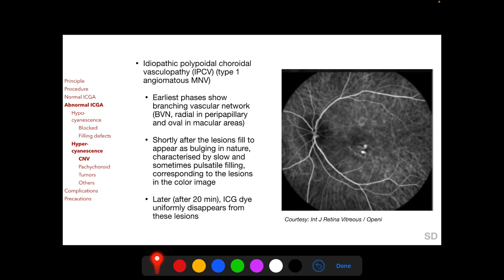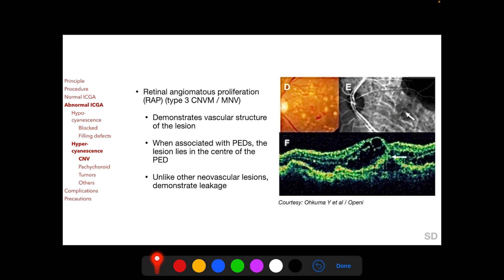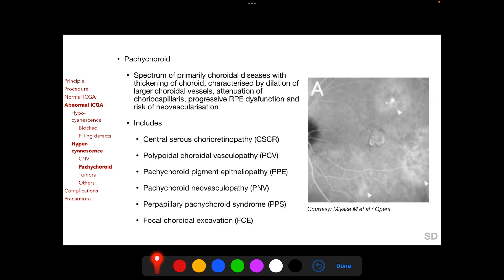After 20 minutes, ICG dye uniformly disappears from these angiomatous lesions. The third is retinal angiomatous proliferation, also known as type 3 choroidal neovascular membrane or macular neovascularization. In these photographs we see the fundus photo showing hemorrhages, the OCT showing the RAP lesion, and the ICGA showing the abnormal vessels. Hypercyanescence on ICGA can also be seen in the pachychoroid spectrum of diseases.